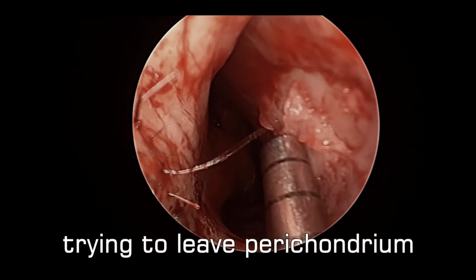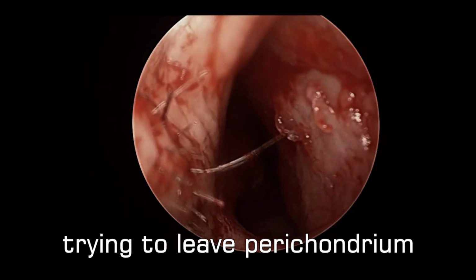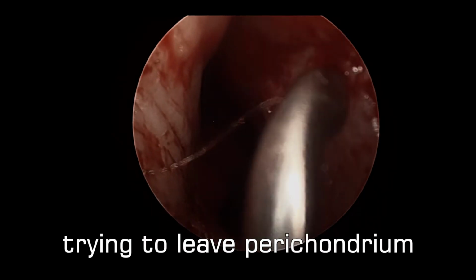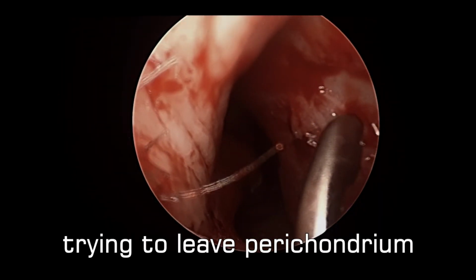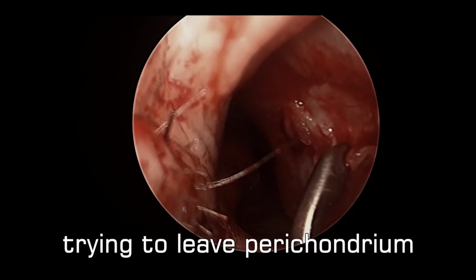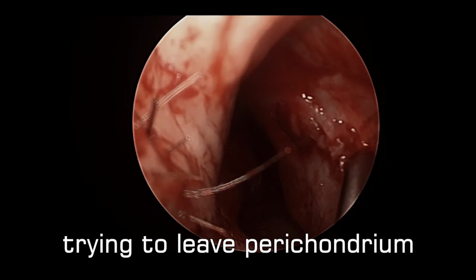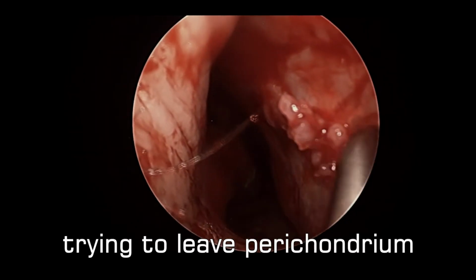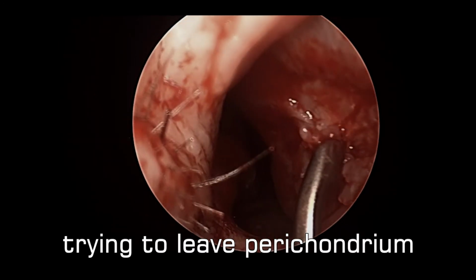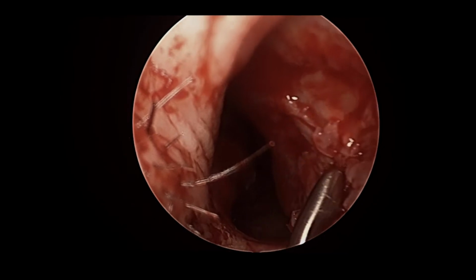As we scrape the area, we are actually trying to leave the perichondrium over the cartilage of the patient's septum. This would be the deepest layer that is directly over the cartilage and actually provides it with nutrition and will act as a very nice substrate for the mucosa to grow over this area. So we'd like to leave this tissue if possible, but scrape away all the unhealthy epithelium that is overlying this area.